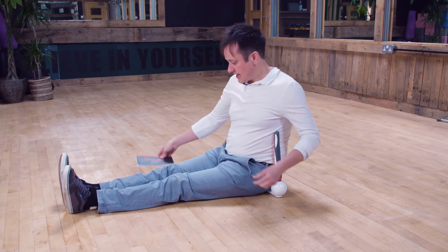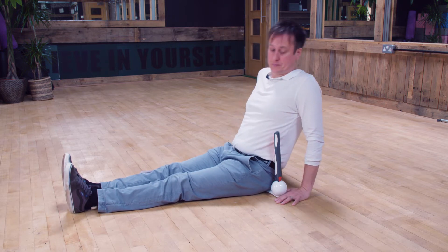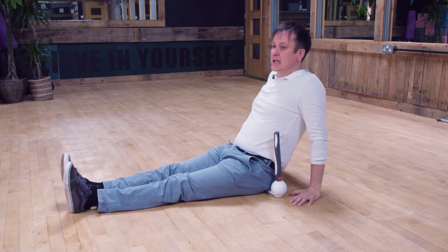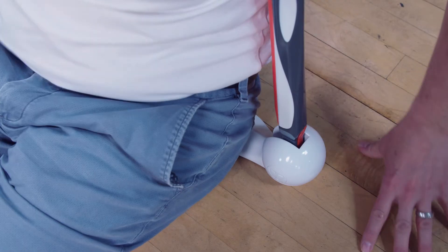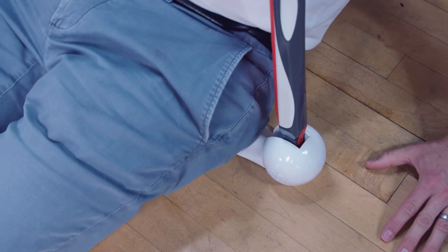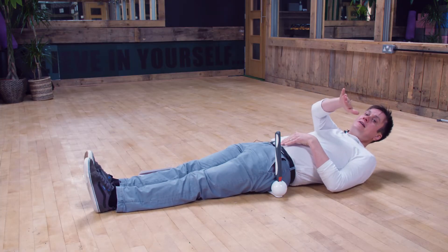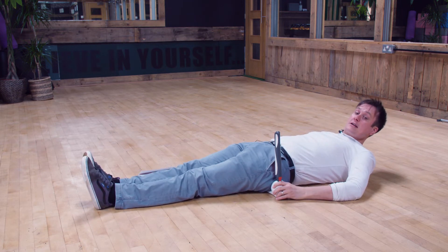Next, and there's a great illustration in the booklet on page six, it illustrates what you should be feeling as you lie back. You initially start on the slope which is nearest you, so as you lie back, don't plant your feet — allow your legs to be relaxed, and let your whole body slide backwards, going up and over the other side of the base onto the slope on the other side.